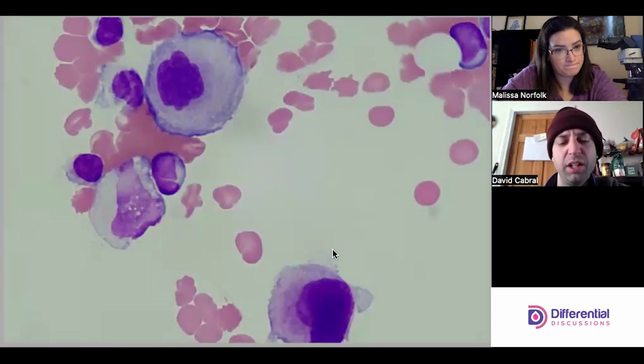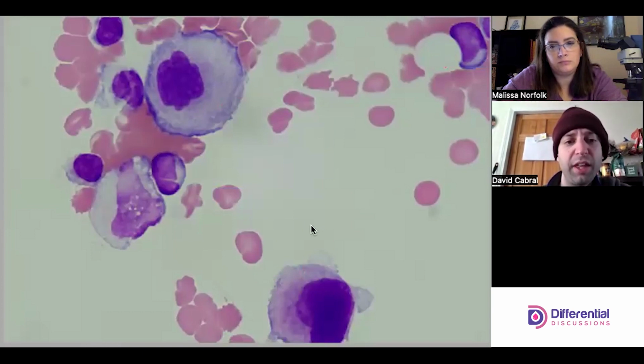I think that's entirely possible, because this one's kind of spooky, but the basophilia and everything, I get that it could be reactive. The thing that's troubling about this one is the cleft there. It's pretty deep. It's hard to say one way or the other.